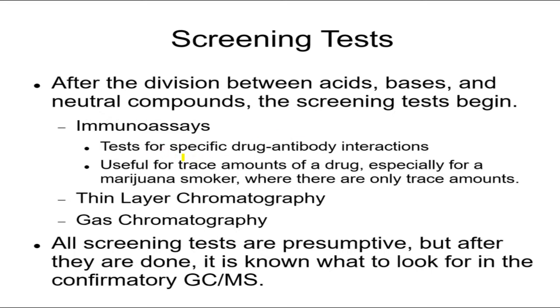This is useful for even trace amounts of a drug, especially marijuana, because it's smoked. So not much gets from the lungs all the way into the bloodstream. That's easy to find. They're very traceable, very small amounts. So this is a great idea to use for small amounts.